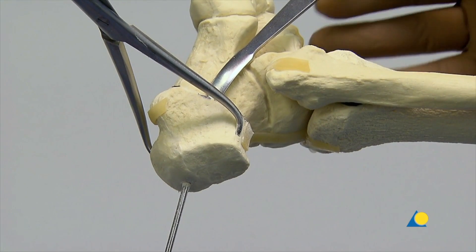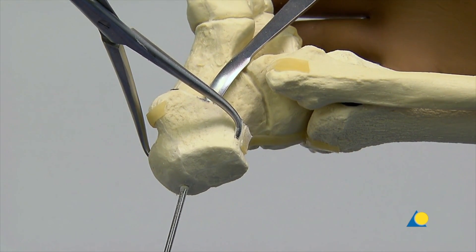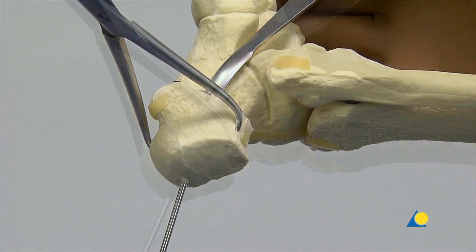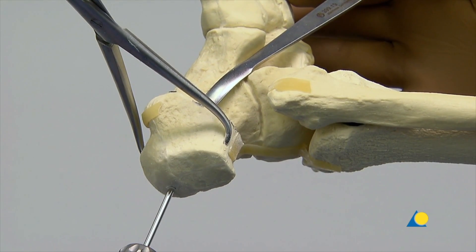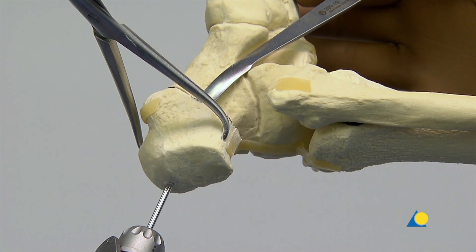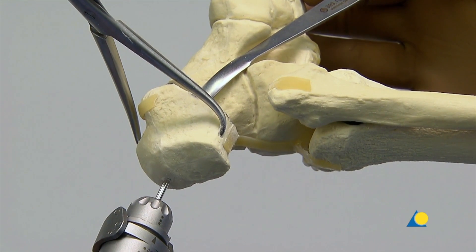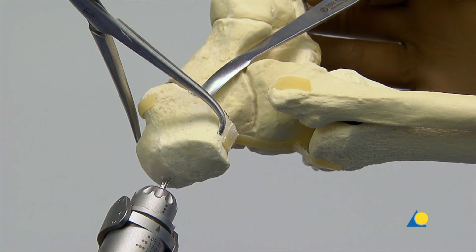A 3.2 mm guide wire is then inserted in the midline of the tuber fragment, perpendicular to the osteotomy in the transverse plane. The guide wire is directed towards the calcaneo-cuboid joint. This orientation of the guide wire will allow compression of the osteotomy without loss of correction.